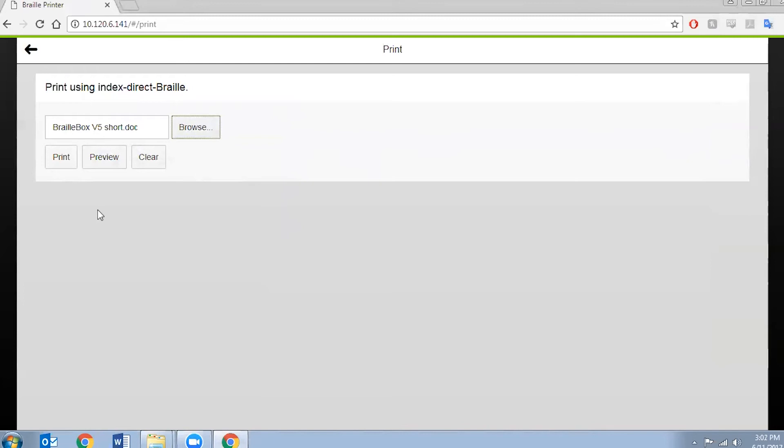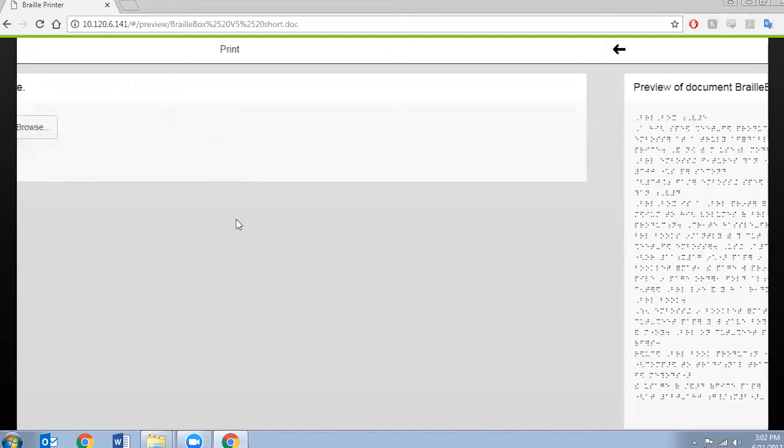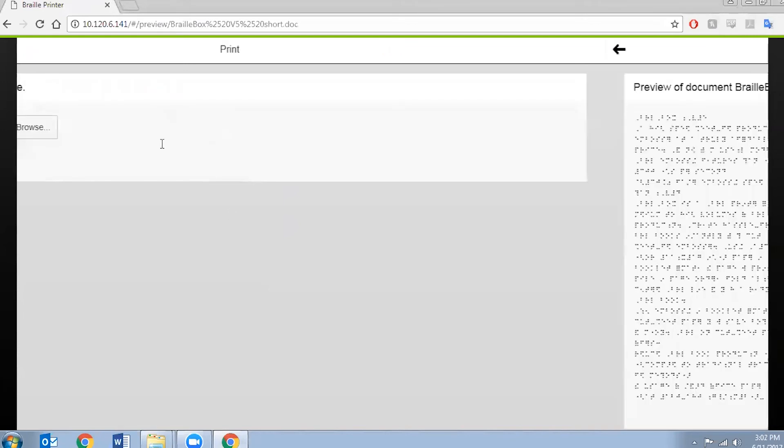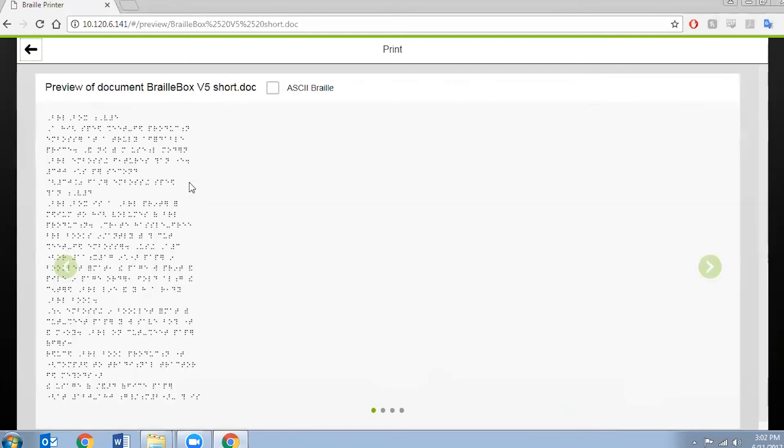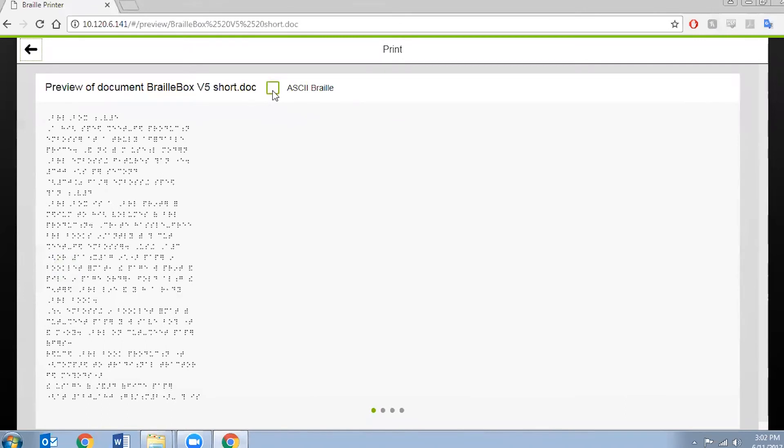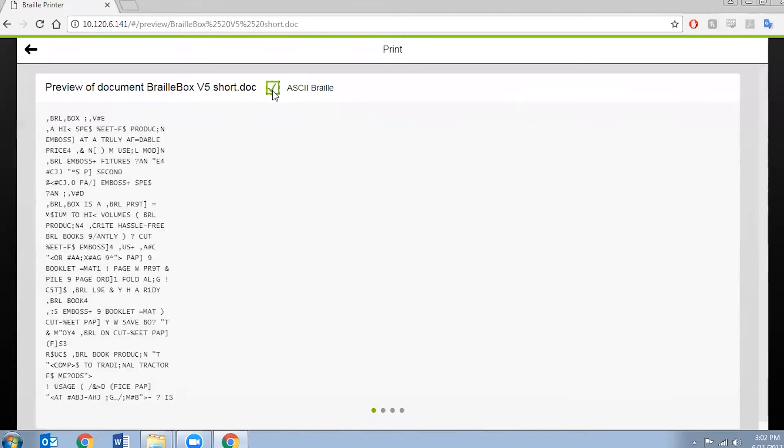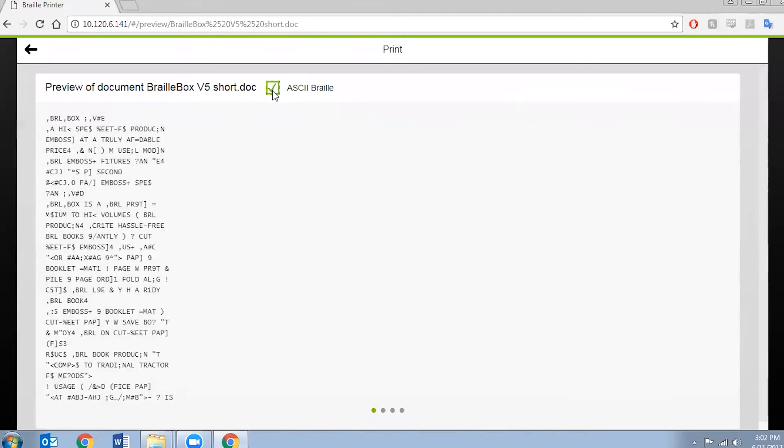I can click on the print preview just to see how it would turn out. So once I've pressed that you can see it's given me a preview of it in print. If I press on the ASCII Braille checkbox over here it'll show it to me in the actual printed text. So let me just do that.